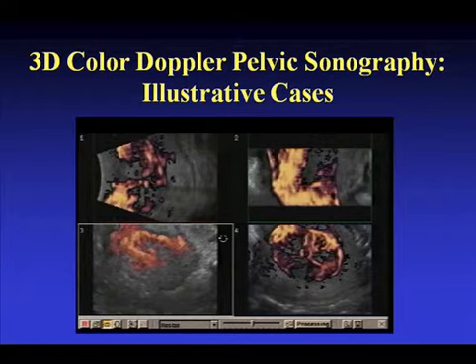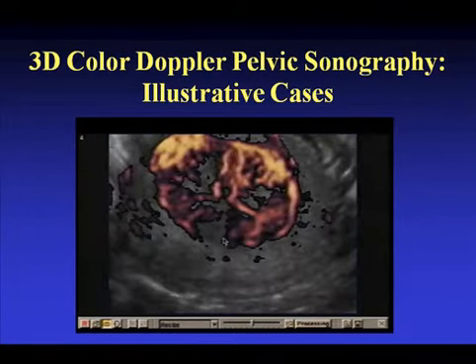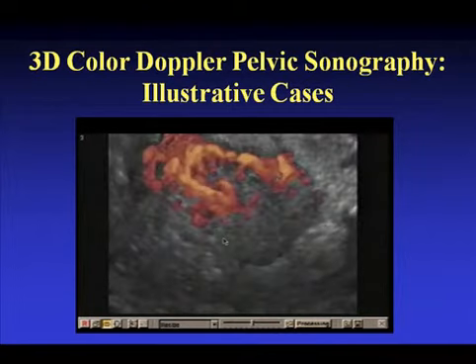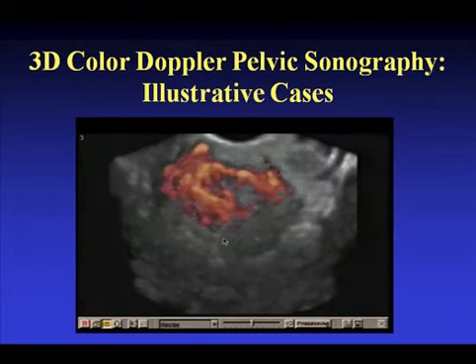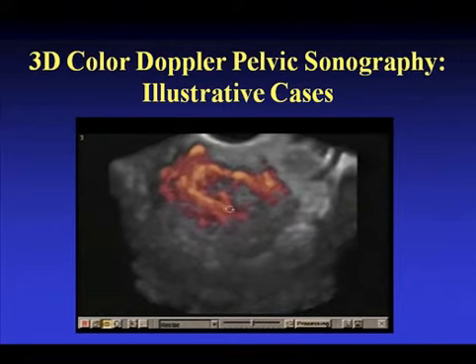We're going to select some of these scan planes to show this. This shows the significant amount of vascularity all surrounding this fibroid. This is the combined sample volume showing the large peripheral vessels supplying this fibroid. We can take this sample volume, we can move it in any particular scan orientation.